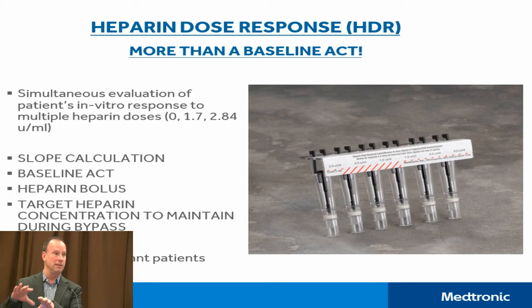And it's not built into the instrument. It's not like it's critical values that are set in the instrument, but they want to put in their policy, hey, at Tampa General or JFK Med Center, the normal slope is like 85 seconds, and here's the range for that. They want to make sure that that range doesn't deviate by 12% the following calendar year. And by them doing that, that alleviates the need for doing any quality control on that particular assay.